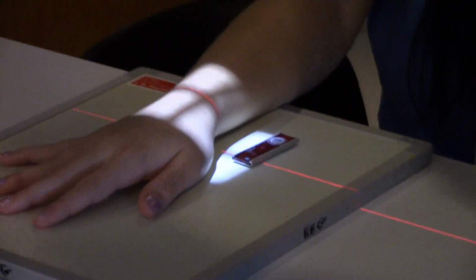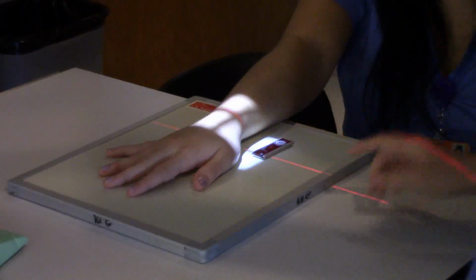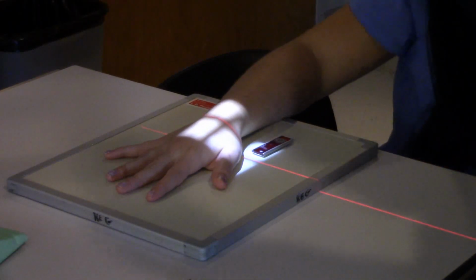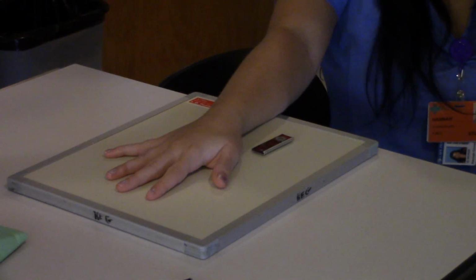All right, next up is going to be PA axial. All right, Ms. Abby, what kind of an angle do we need on this tube? I got 13. Okay, 13 degrees.